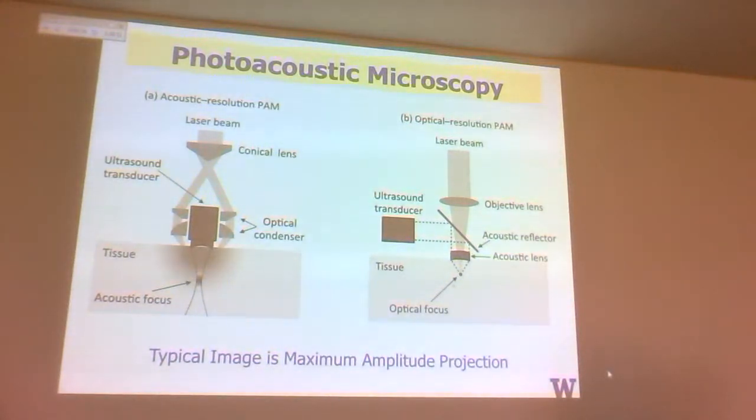areas of emphasis. One is in intravascular, and the other one is going to be for real-time applications for guidance types of things and monitoring things, where you're talking about penetrations of 2 to 3 centimeters. Okay? So not whole body, but penetration to the. So there's lots of applications for that. Breast, peripheral nerves, endoscopic things can go there. Okay, the third one is microscopy.